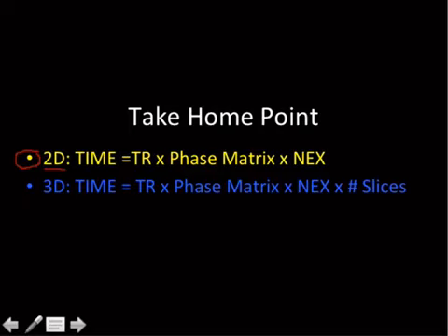When you see those charts, there's a chart in Crack the Core, there's a chart in one of the prior MR lectures, or just Google it. Any chart, literally any chart that you'll find, when we talk about slice thickness, is going to have a column for whether this affects your scan time, and they will always say no. But sometimes it does, and that is when you're dealing with 3D imaging.